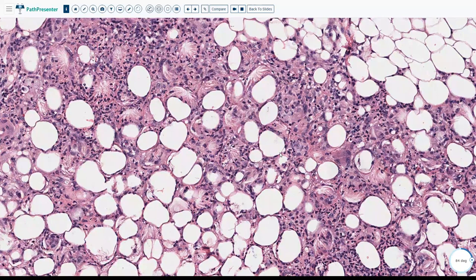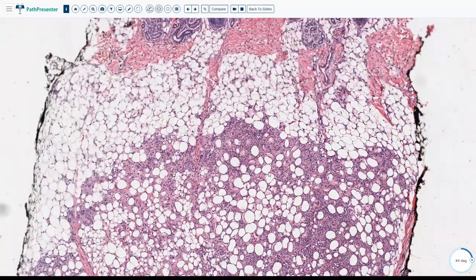A similar condition is seen in post-steroid paniculitis, where the biopsy also shows needle-shaped crystals within the fat cells. Sclerema neonatorum will also show needle-shaped crystals, but the key differentiating feature is the absence of inflammation. If you see only needle-shaped crystals without significant inflammation, think sclerema neonatorum. If you see crystals with significant inflammation, it is either subcutaneous fat necrosis of the newborn or post-steroid paniculitis — the clinical history will differentiate between them.